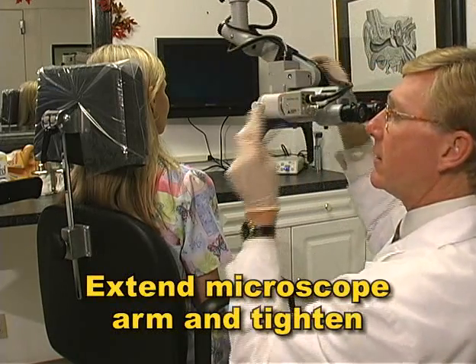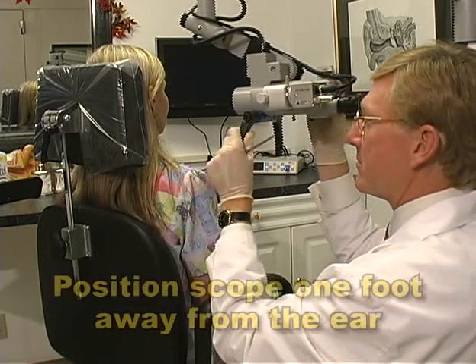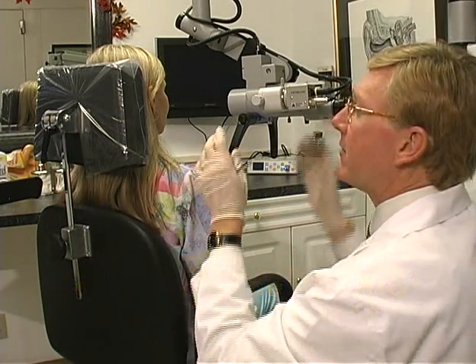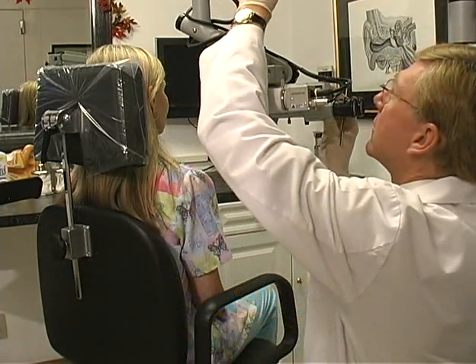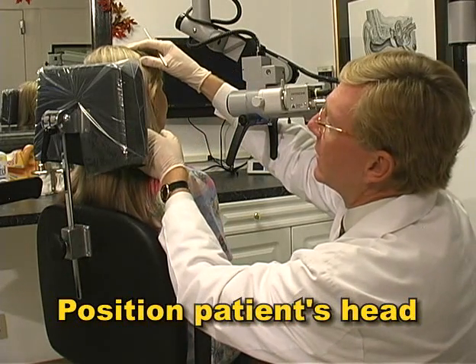Take the Omni-10 handle and adjust the microscope's arm so that it's approximately one foot away from your patient's ear. If the arm moves or drifts, tighten the lock. It also helps to tilt the patient's head slightly away from you.